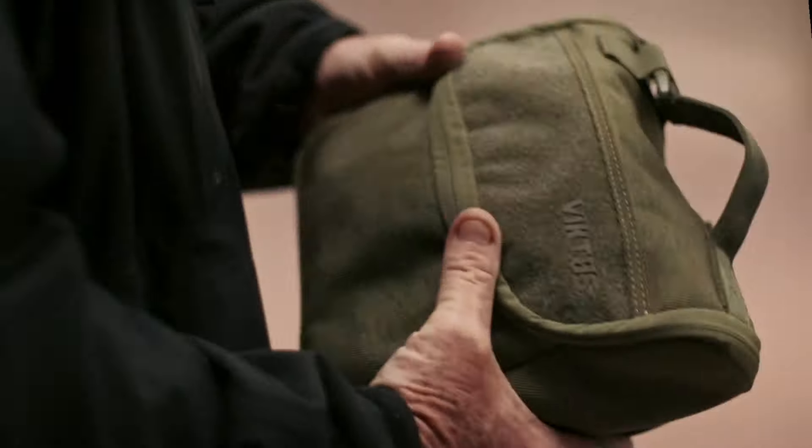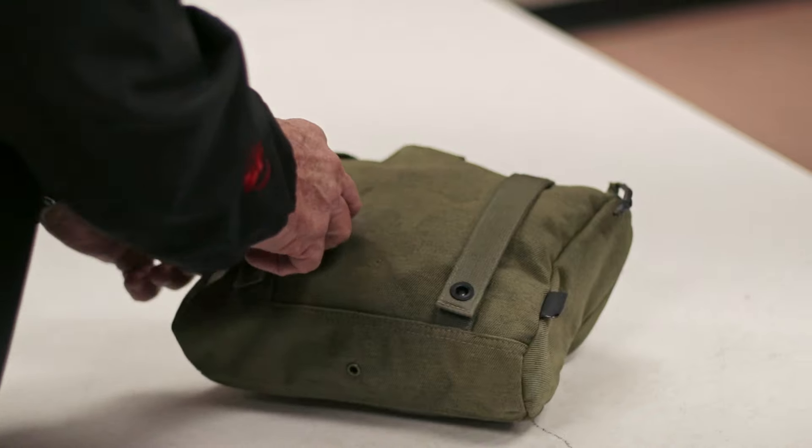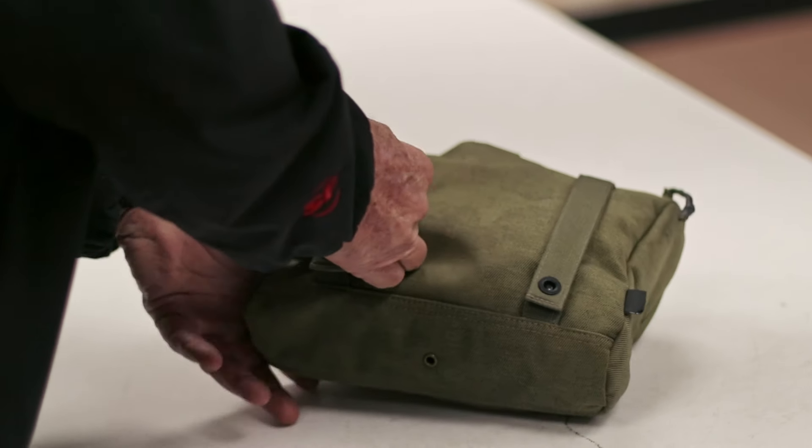If you want to see what's in here — on the outside of the med bag, right here on this side, there's a complete VOK kit.